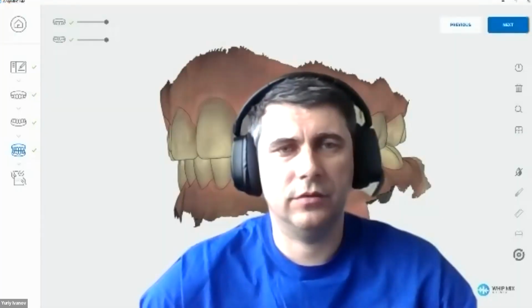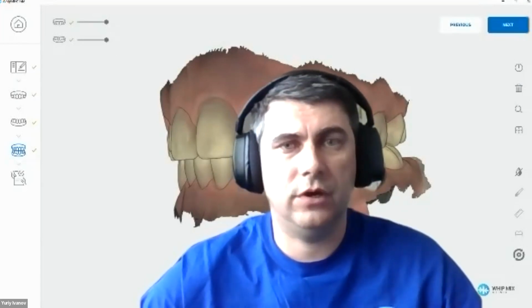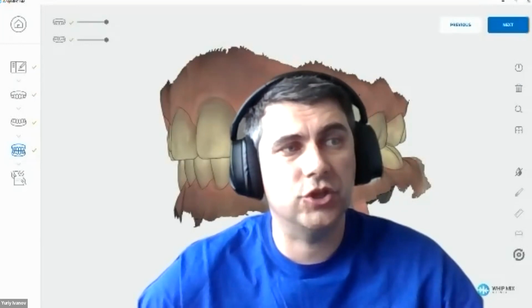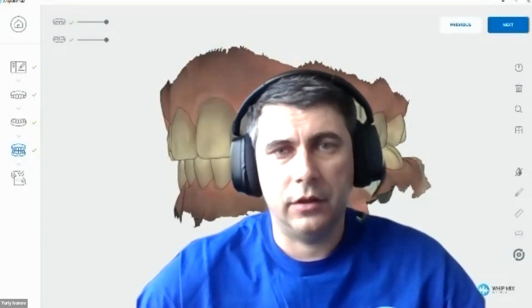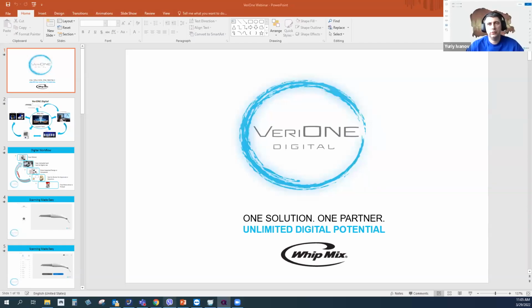Thank you, Bryce, and I hope anyone could hear me clearly. And yes, as Bryce told us, my name is Yuri, and today I will present you one digital workflow. And I wanted to share my screen to show my presentation right now. And yes, I hope anybody could see my screen. Okay, thank you very much.